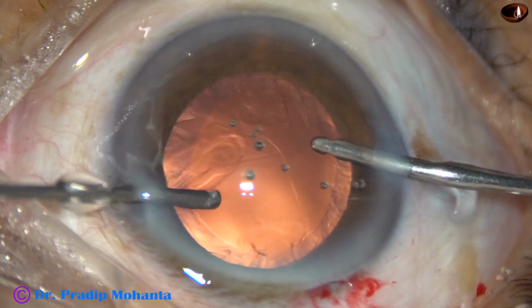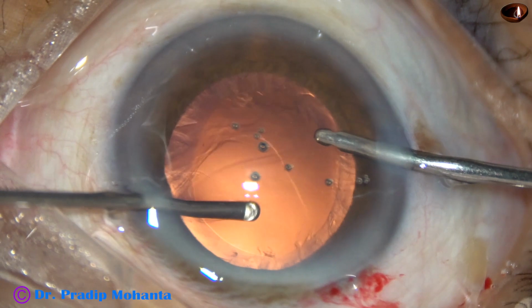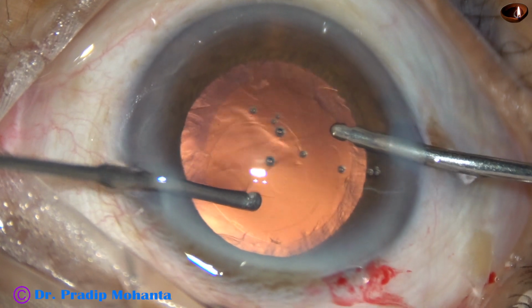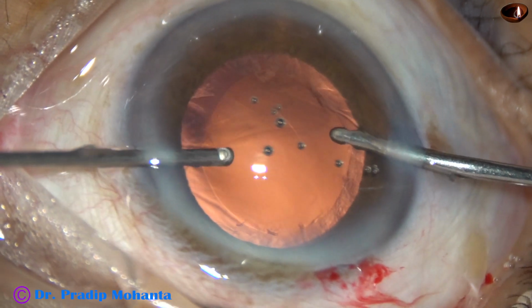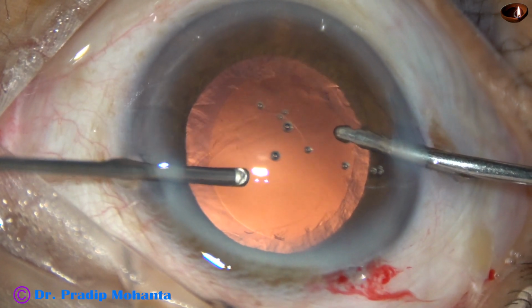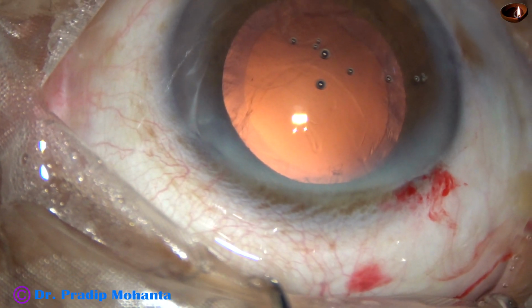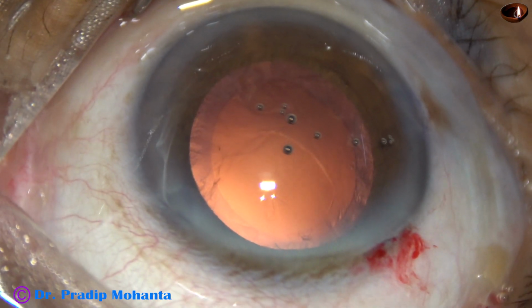Introduce the cutter in the anterior vitreous, 3 to 4 millimeter behind the posterior capsule. Place the cutter there and move slowly from one place to the next, because you may pull the vitreous. So be sure that you have cut the vitreous strands and then move to the next spot.